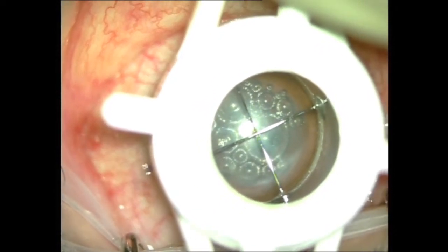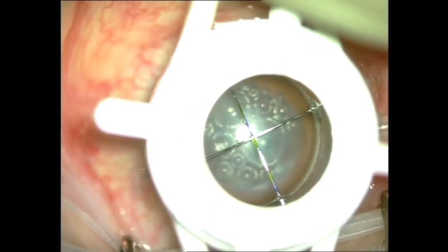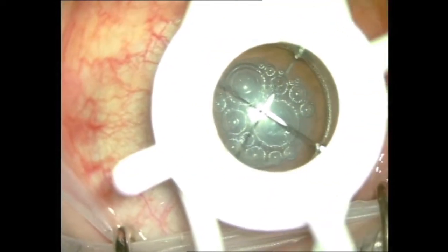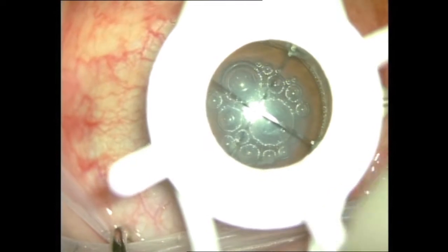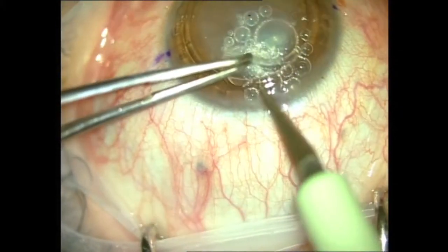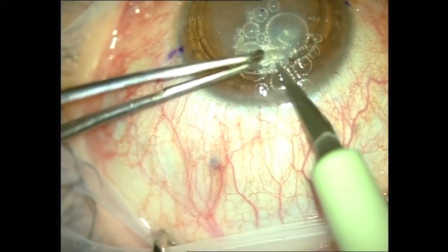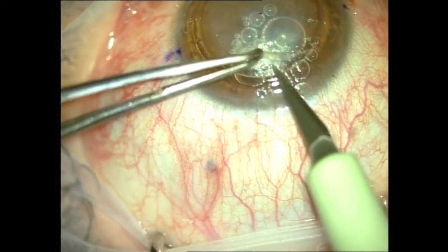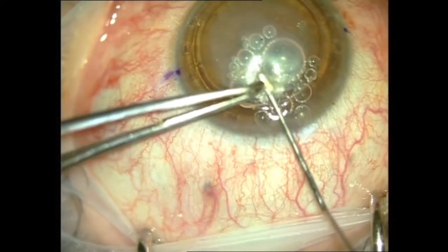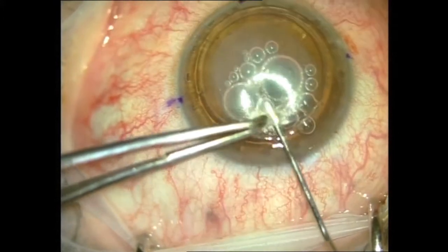This is followed by partial thickness trephination to a depth of 350 microns. After checking the depth of the trephination, I usually perform a small incision in the corneal stroma to introduce the blunt air injection cannula.